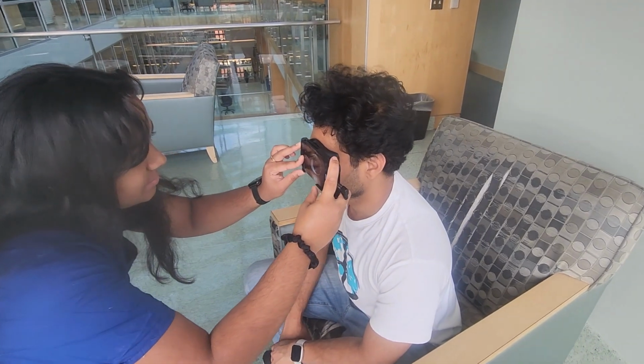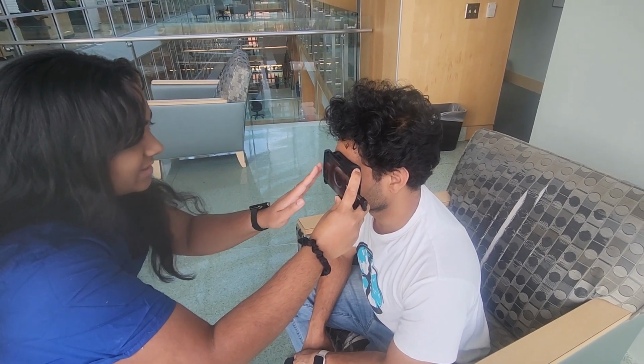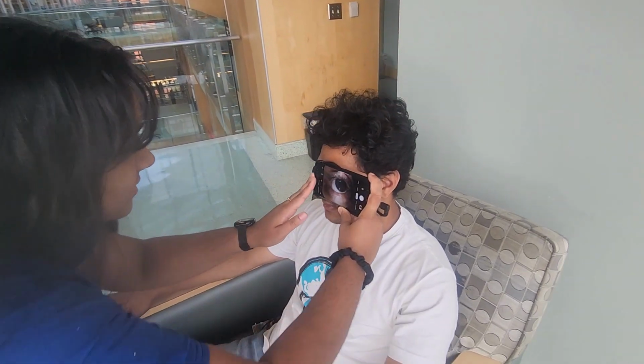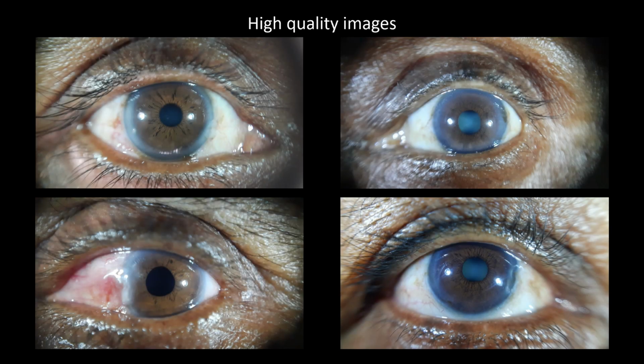Instruct the patient to look at your forehead so the patient's pupil is centered on the imaging screen. When you are satisfied with the eye position and you are ready to take a picture, tell the patient to blink once and then open their eye wide. This helps to clear any extra tears from the eye. Then capture the photo. Now we check if the image is high quality.